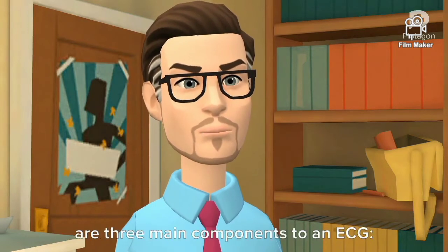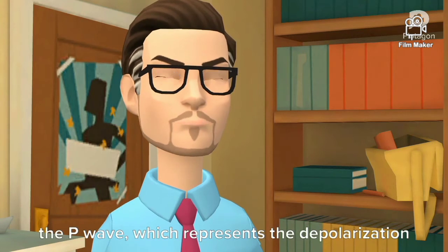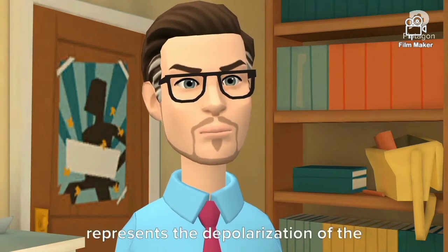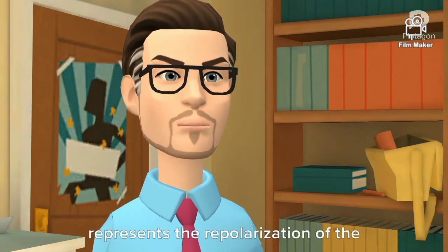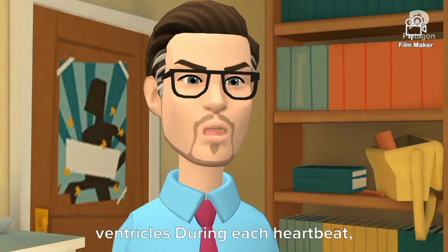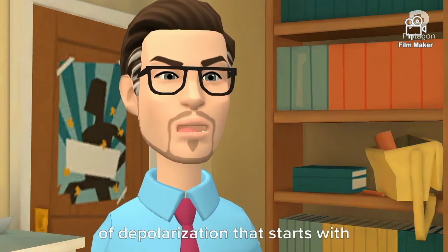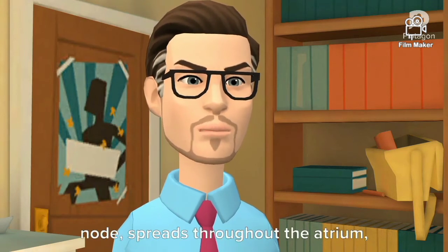cardiac cycle. There are three main components to an ECG: the P wave, which represents the depolarization of the atria, the QRS complex, which represents the depolarization of the ventricles, and the T wave, which represents the repolarization of the ventricles.